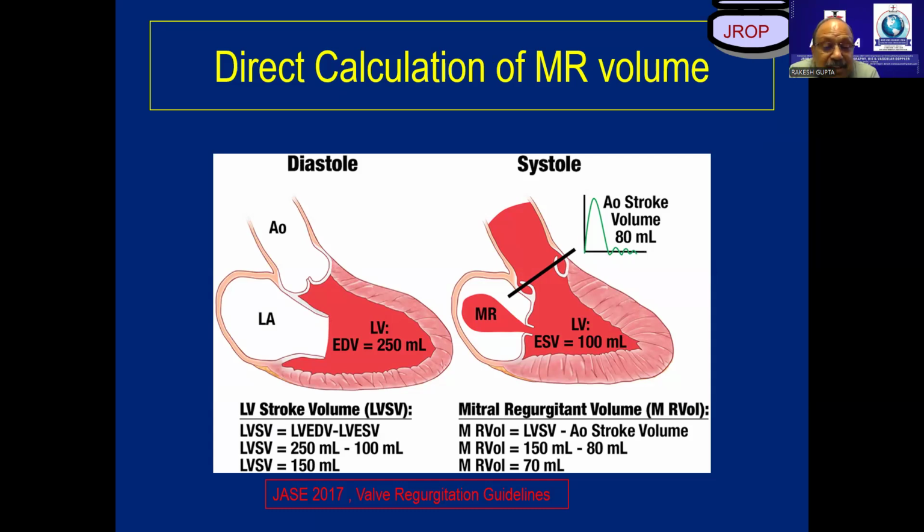Look, there are 10 methods of calculating the severity of MR. At your level, remember what has been told to you. Don't get into PISA, because PISA gives you a very erroneous value a number of times because of the number of values which are to be calculated.